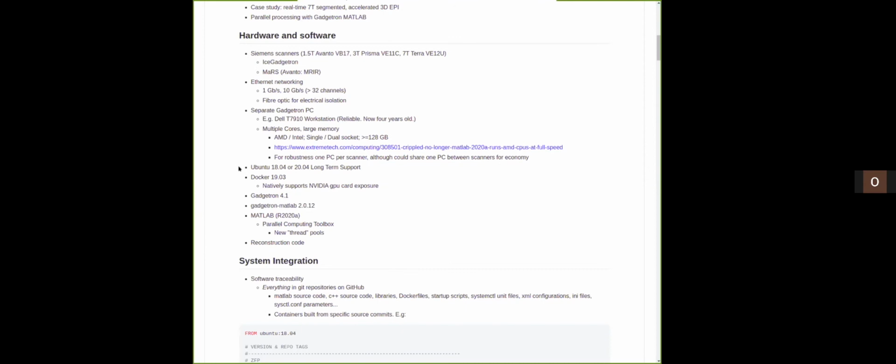For GPUs, I think that the support within Gadgetron is CUDA, so it's NVIDIA tied. Although I suppose there's no problem in an AMD CPU with NVIDIA GPU plugged in as well. Correct me if I'm wrong, David or whoever. No, that works beautifully. I'm running that exact setup here.